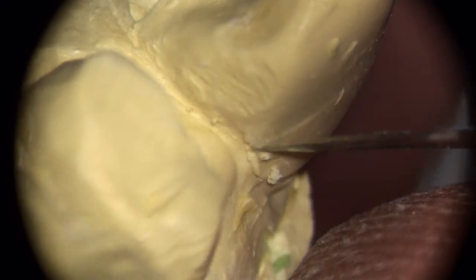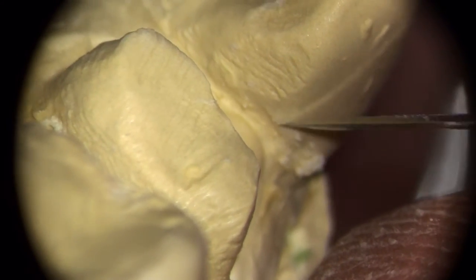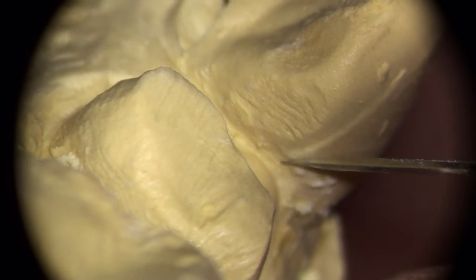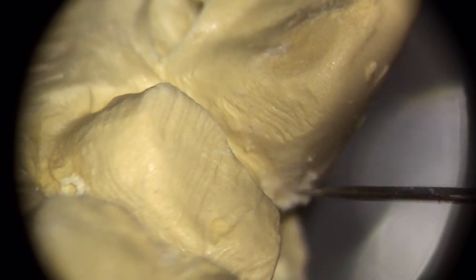Now that looks like a drag to me, so it's got no texture to it. Probably just complete air inside the impression where that drag was. So we'll trim that off. Notice there's diamond marks on this adjacent tooth. So one of the doctors may have tried to improve the line of draw a little bit. May have been previous Dr. Prep or this latest one.